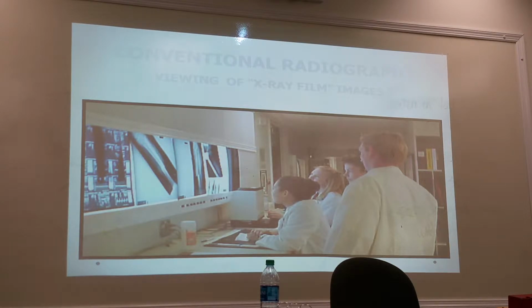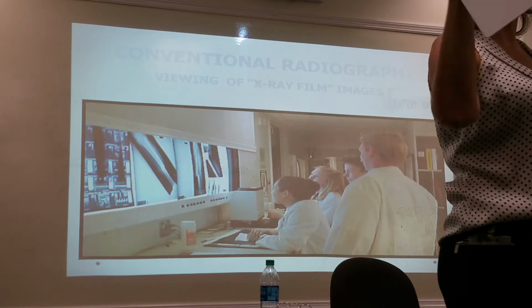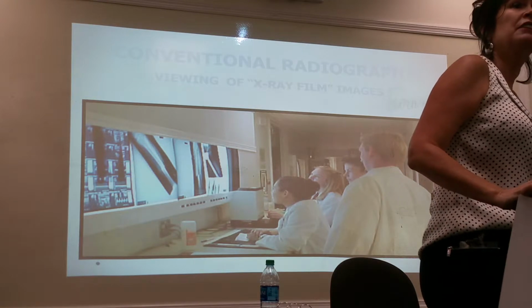The other issue with these cassettes and film is that lots of things could affect film. If you expose it to light, expose it to excessive heat. I had a box of film that the expiration date was over and it was fogged. Lots of things can go wrong with film. So it's nice with these CR cassettes that the cassette is only to support this. It doesn't protect it from light or anything like that, unlike these other cassettes, which protect the film from light.